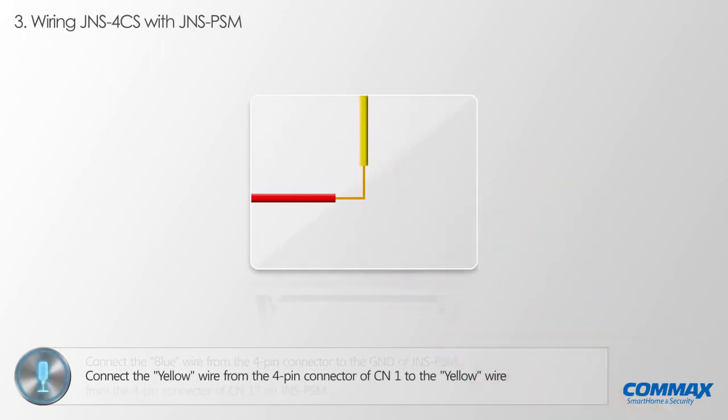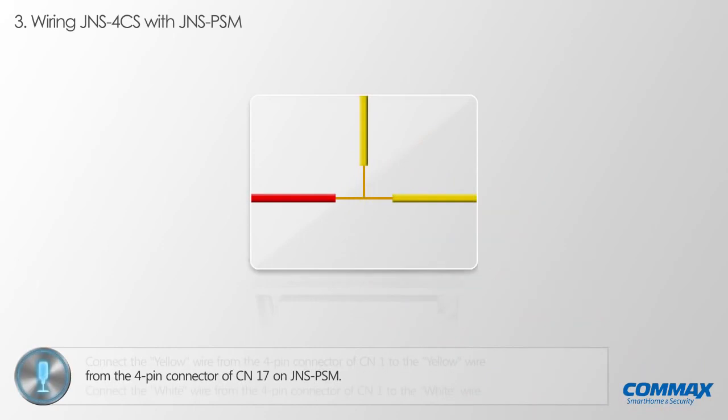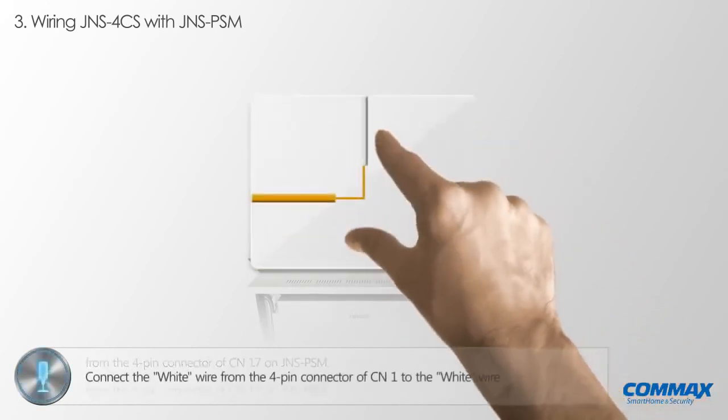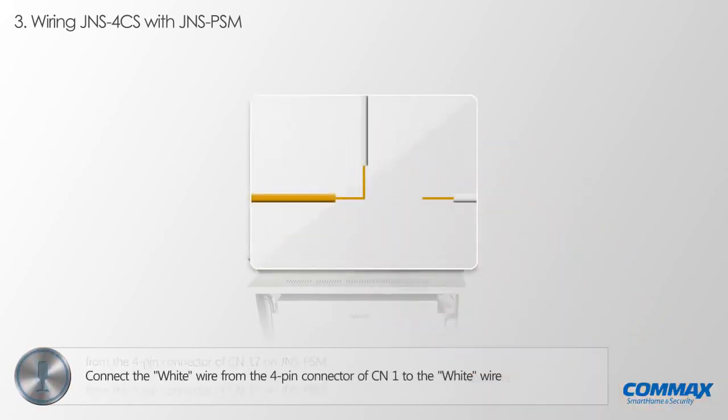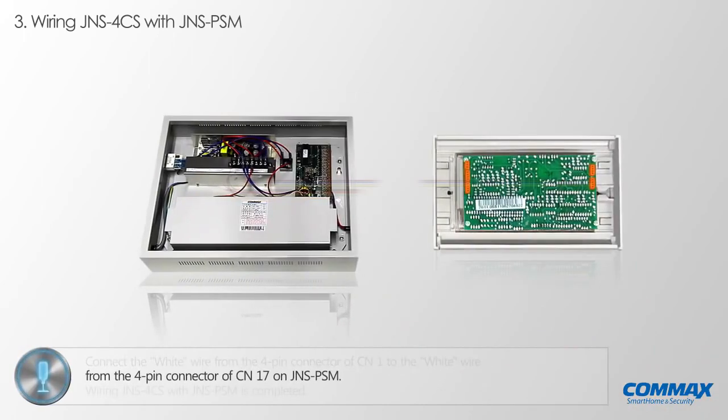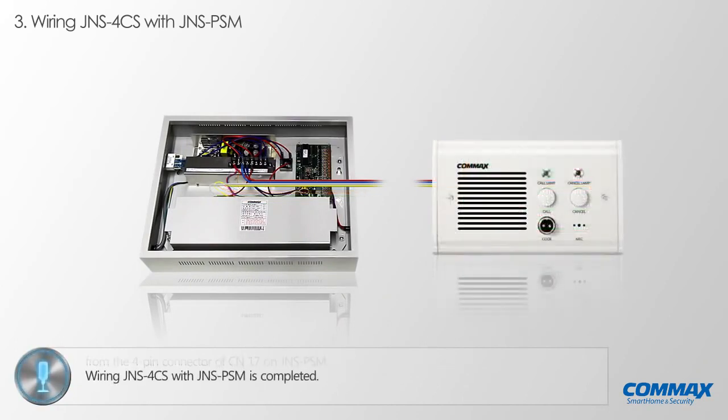Please connect the yellow wire from the 4-pin connector of CN1 to the yellow wire from the 4-pin connector of CN17 on JNS PSM. Please connect the white wire from the 4-pin connector of CN1 to the white wire from the 4-pin connector of CN17 on JNS PSM. Wiring a bed console JNS 4CS with the main panel JNS PSM is completed as shown above.